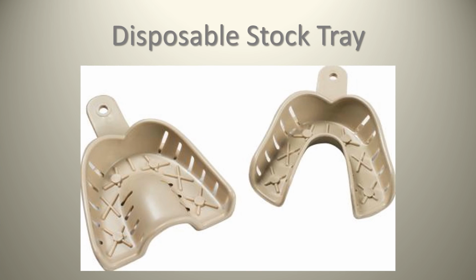Now, there's going to be other trays out there. One practice I used to work in, they actually used to do a lot of Invisalign. I used to get the impression trays from Invisalign for free, so we used to end up just using those for our open tray impressions for dental implants. We'll try not to tell Invisalign that, but God bless them for sending those to us.